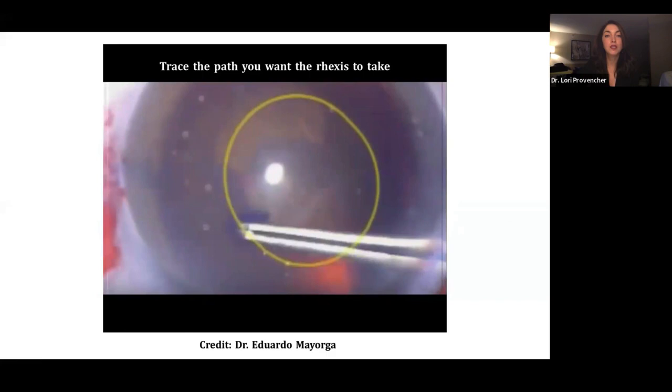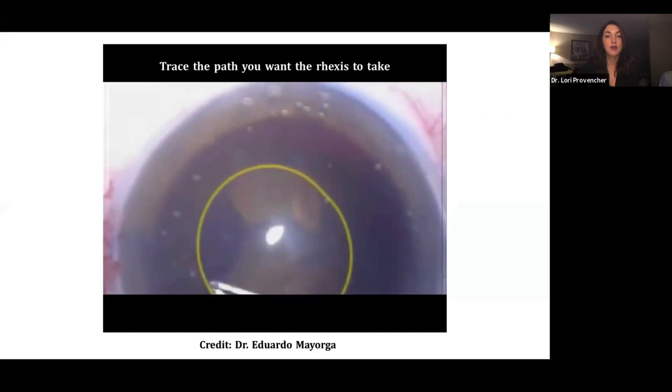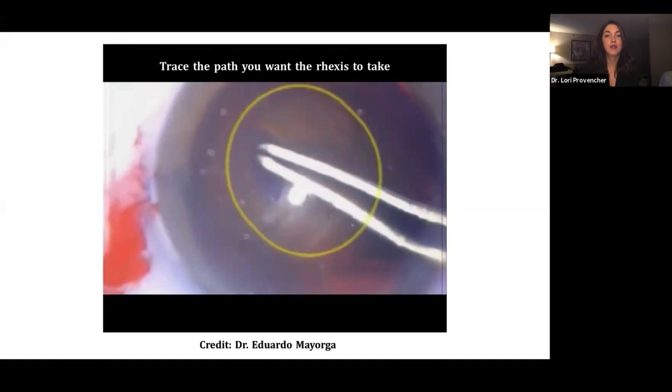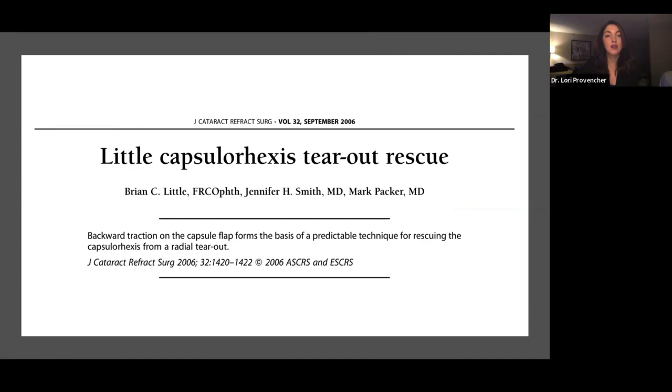Under a normal circumstance, this works very well and can be applied in pretty much any situation where you have a stable, nice chamber that's filled with OVD. The rexis should follow this path. The other tip for capsulorexis that I have is understanding and knowing the little technique to rescue a radial tear. It's something I think you must know before you start to do continuous curvilinear capsulorexis. Once you understand this technique, you really understand how a rexis in an anterior capsule behaves.